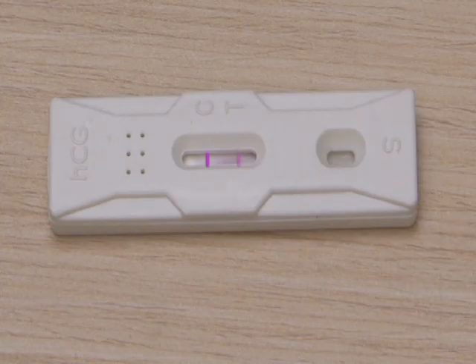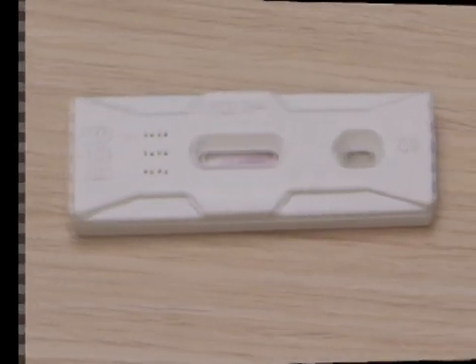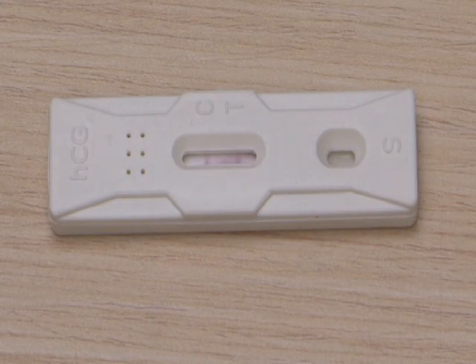Weak pregnancy test. If the color of the line at the T end is weaker than the color of the line at C end, repeat the test after 2 to 3 days. If still weak positive, refer her to the doctor.